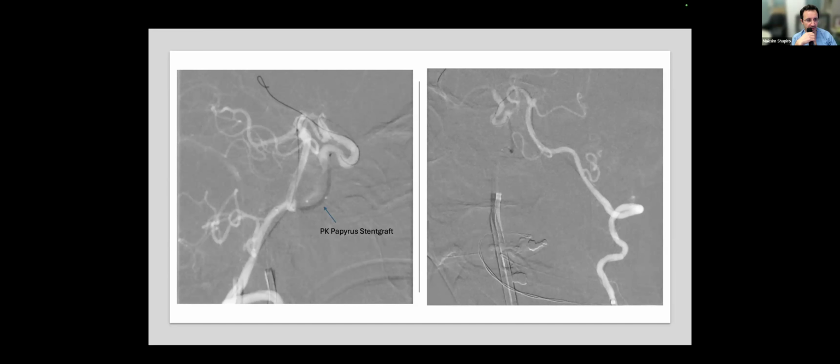Our experience is very limited with this device. We have a couple of cases. For me, I just prefer to put the intermediate catheter beyond the level of wherever the stent is going to be. Shove something heavier, some sort of heavier intermediate. Like here, you could get it up to the upper cavernous, to the horizontal cavernous, and then hope that the thing goes. It's definitely the best in terms of navigability. I would say it's the best of the worst.